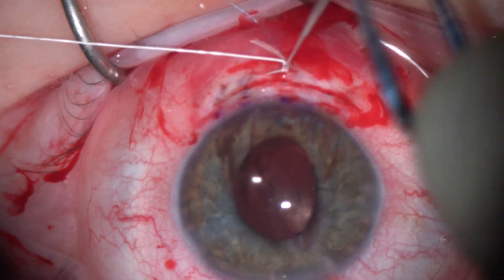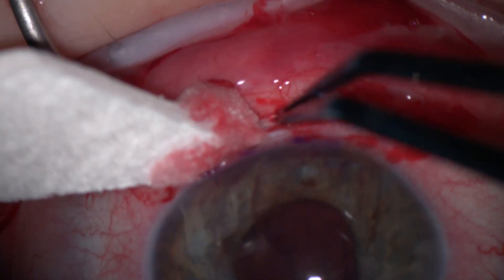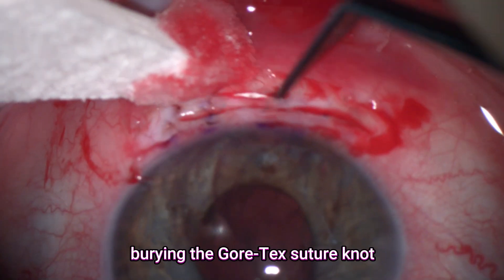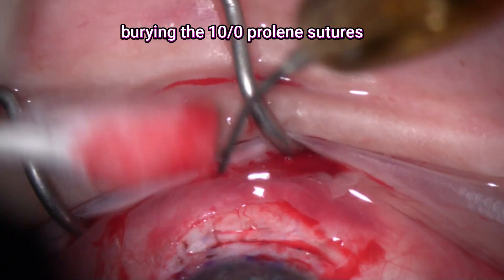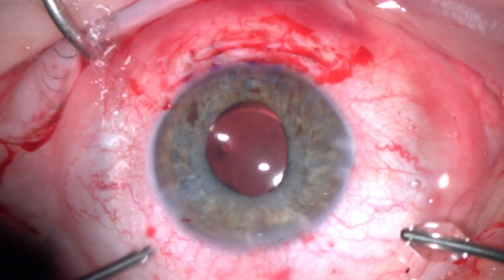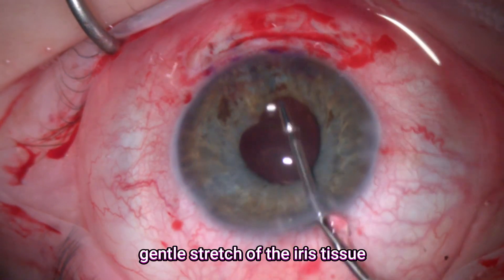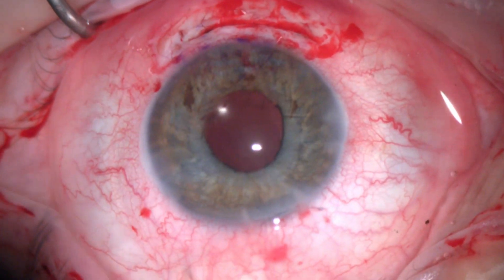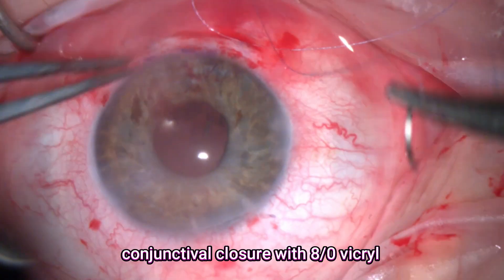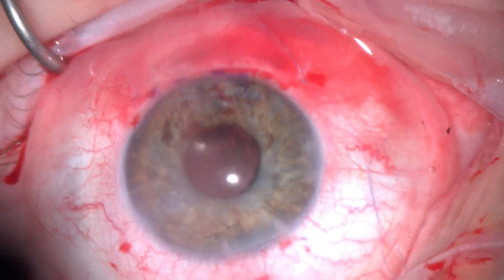Then I'll tighten the Gore-Tex suture, as the lens implant appears to be well centered. It's really important to bury this Gore-Tex suture to avoid any late erosion. So with the aid of a Sinskey hook or MST 23 gauge forceps, I'll just push it in the groove to make sure it's fully secure. Then I'll go back to the anterior chamber and do a good eye air-fluid exchange. I'll gently stretch this iris tissue just to prevent it from curling at the angle.